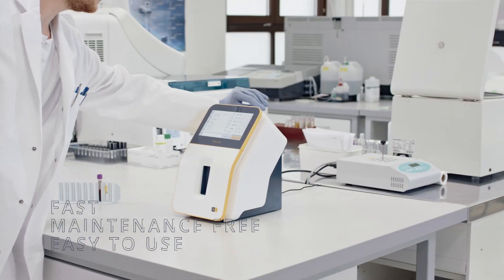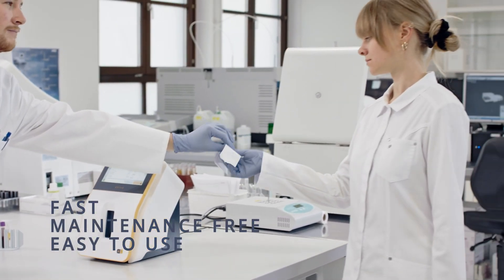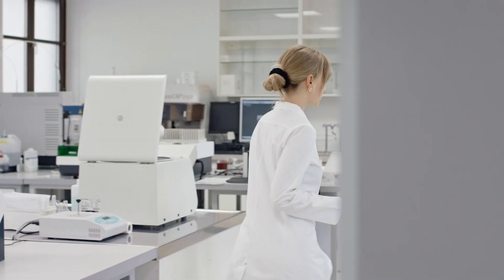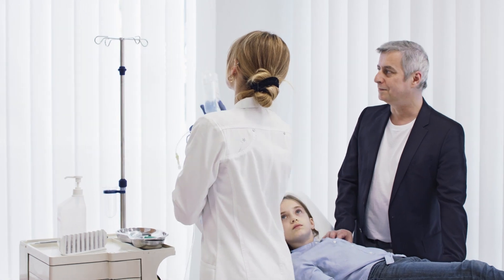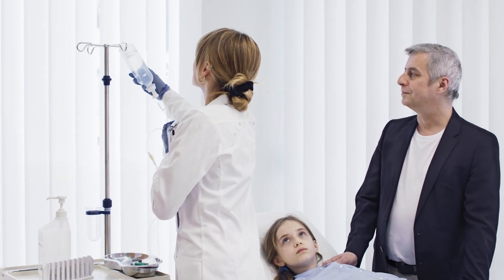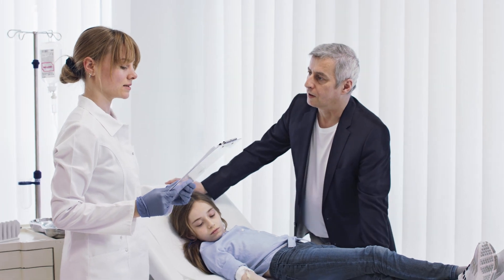Fast, maintenance-free, and easy to use, the Exius E1 Analyzer revolutionizes the future of electrolyte analysis. A task we accomplished by devoting ourselves to the most important value in healthcare, the welfare of your patients.